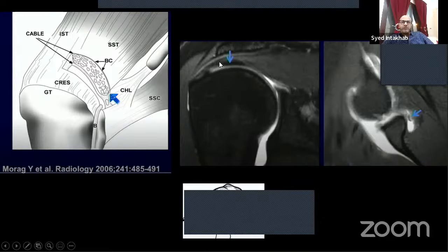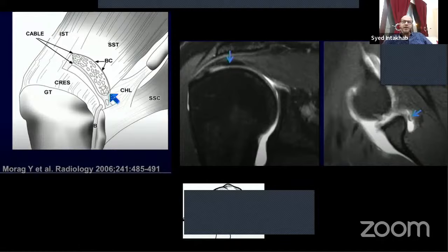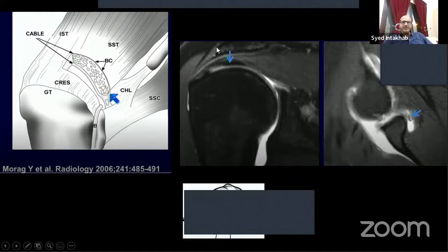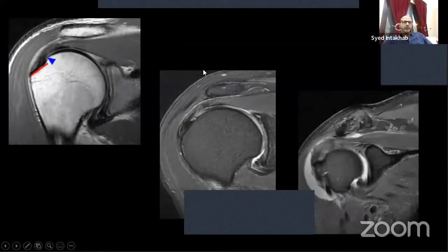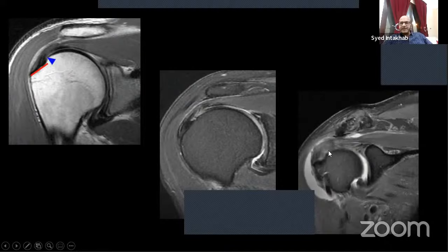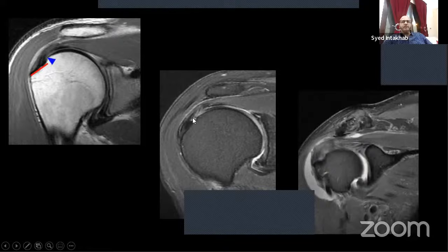From the cable and crescent concept: in the coronal image, there is an area of darker, condensed fibers called the cable, with the crescent adjacent. Some rotator cuffs have a dominant cable — in those patients, if there is a tear, retraction will be less. This concept of cable and crescent has become important in the last 10 years.